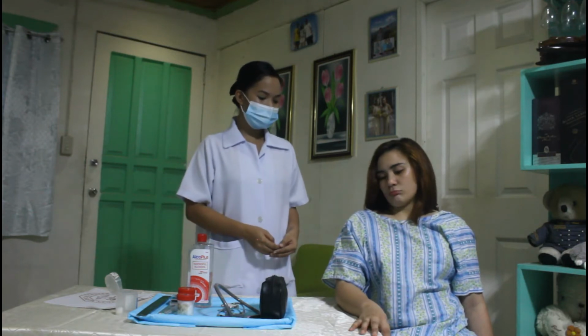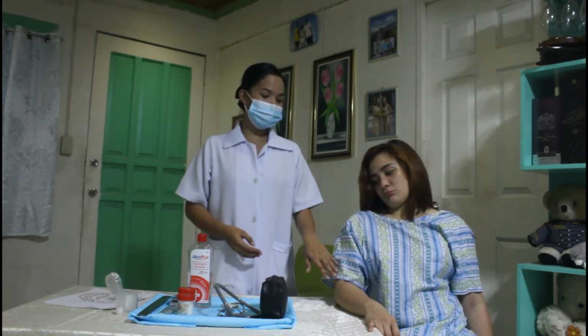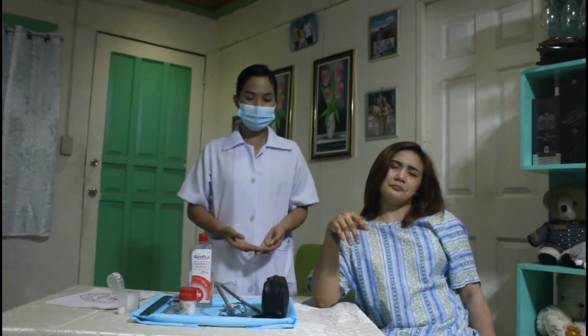Ma'am, kindly bend your elbow into 90 degrees. This position of the lower arm with the wrist extended allows easier artery palpation.